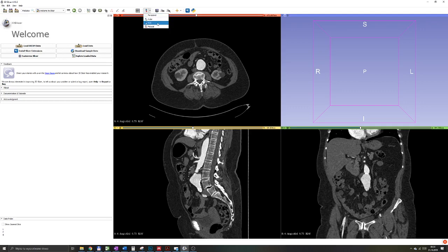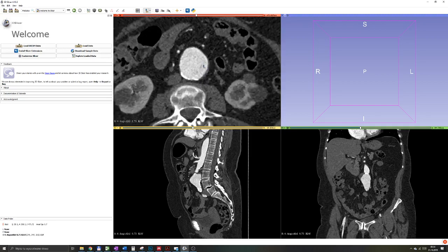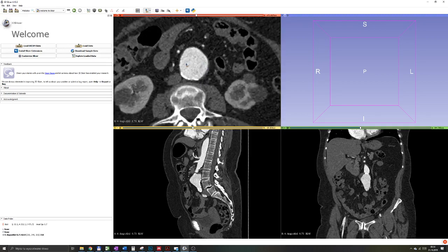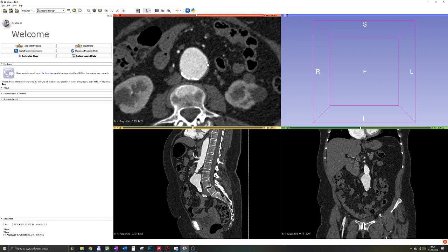You can ignore the ROI and the fiducial markers now. Click on the ruler, and now you can zoom in on your structure, and make the measurement by clicking on two opposite sides of the structure, 1 and 2.